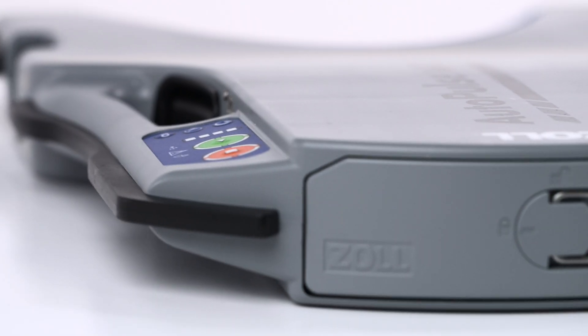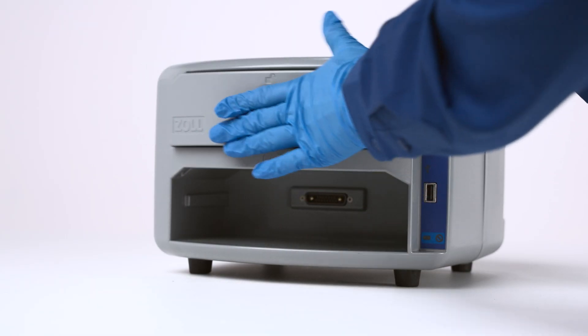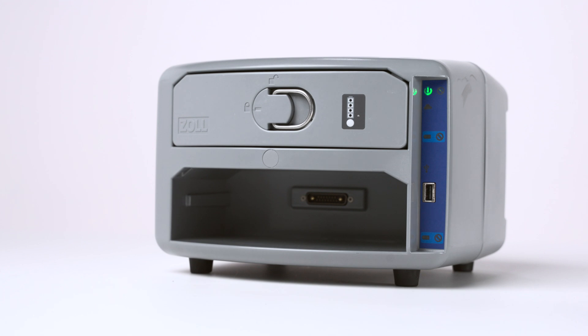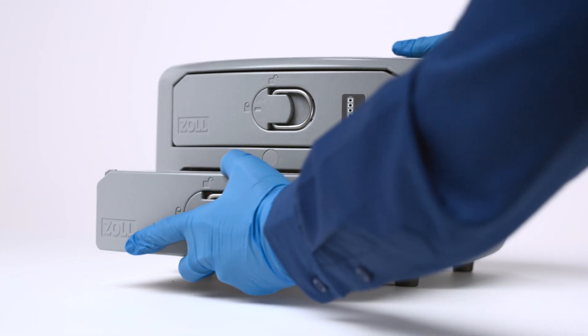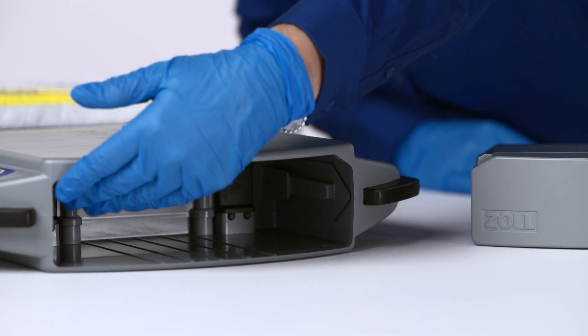Before installing a battery in the AutoPulse NXT Resuscitation System, fully charge the battery in the battery charger. This brings batteries out of low-power storage mode. Also, ensure the battery compartment located at the top of the platform is clear.